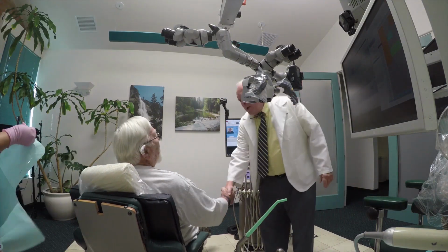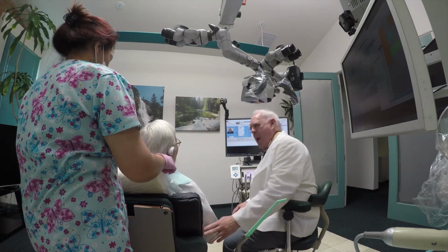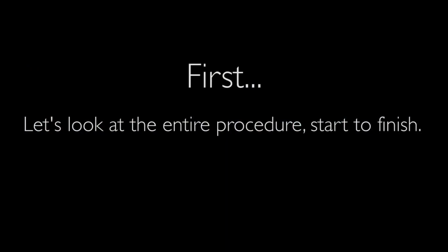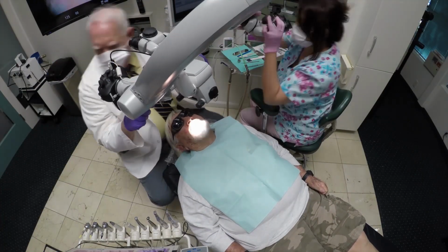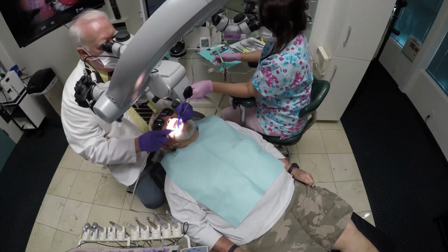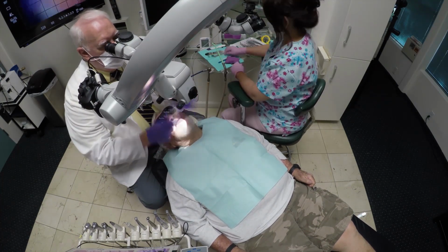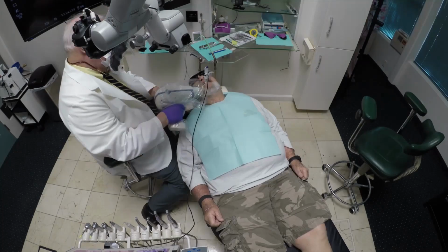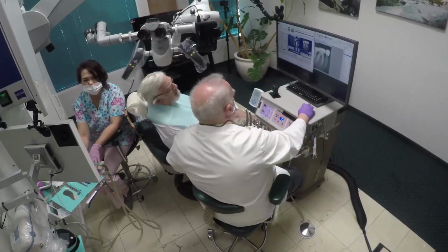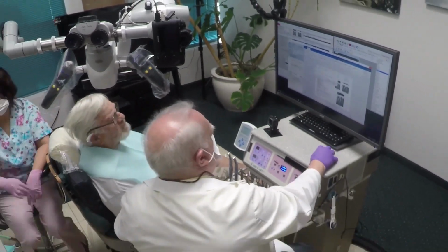Take a look at how TDO accomplishes all of these things easily and effortlessly during a recall exam. What we're going to do is show the entire recall exam. It was 7 minutes long. We sped it up so you can see all of the things that we've done, and nothing has been cut out. This was the entire recall appointment, from talking to the patient to the final sending of the report to the referring doctor to describing the case with the patient.